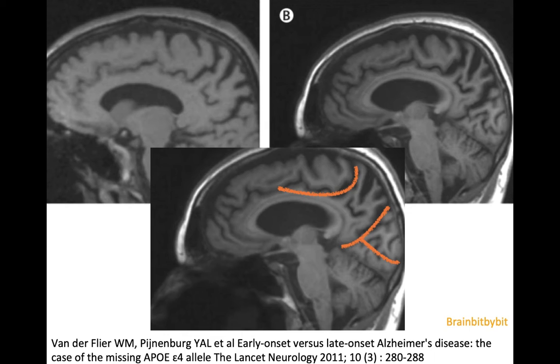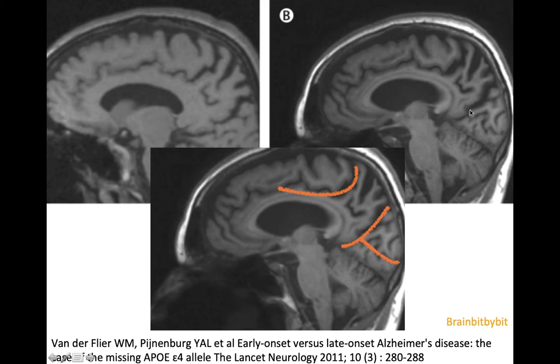There is a special form of Alzheimer's disease occurring at a younger age with a familial component. In that case, there is not atrophy of the hippocampus but of the precuneus. This is a normal control, and this is a patient with early-onset Alzheimer's disease. The precuneus is located just above the parietal occipital sulcus, which forms the letter Y on its side with the calcarine, and just behind the marginal ramus of the cingulate sulcus.